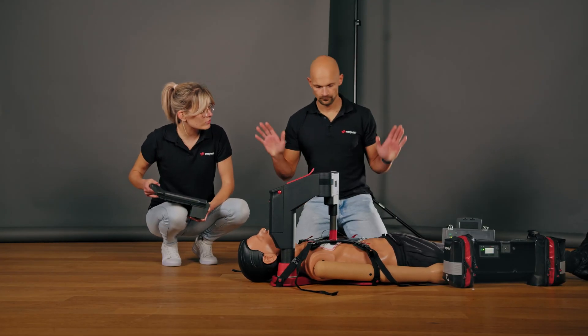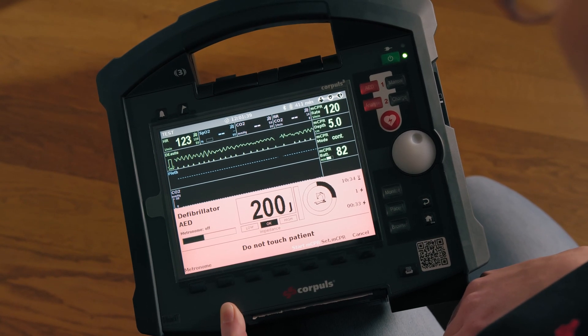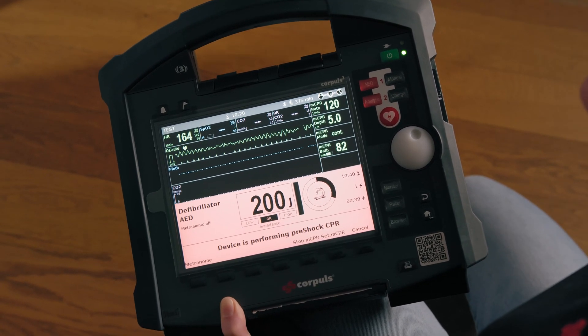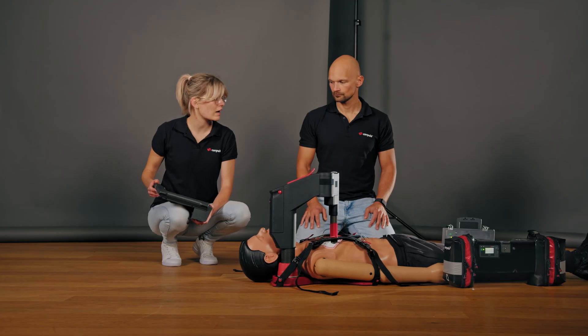Everyone move away from the patient for rhythm analysis. I'm out of the way. It looks shockable to me. Do you agree? Okay then, we will shock in a moment.